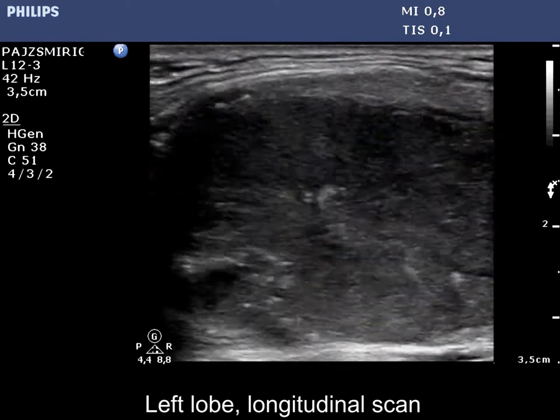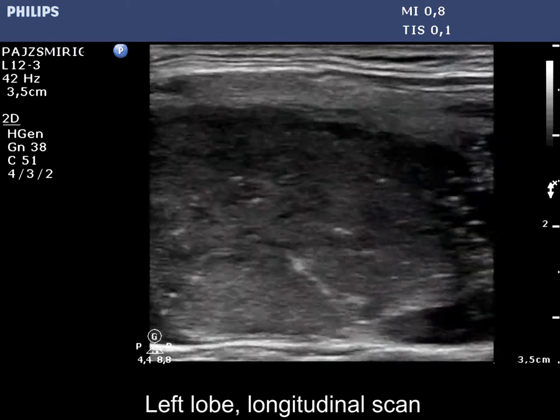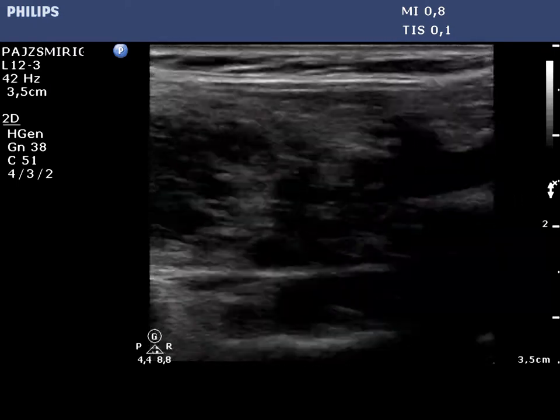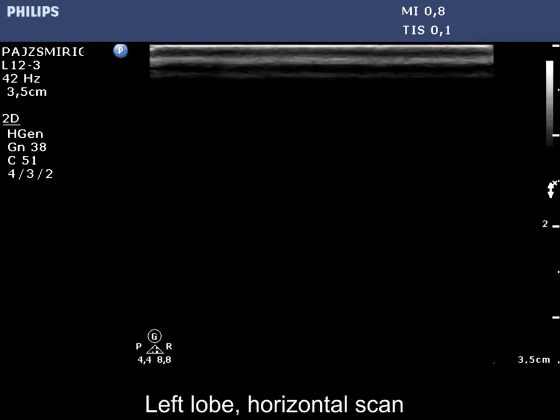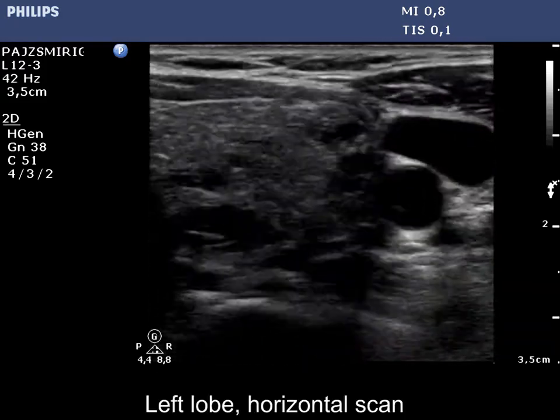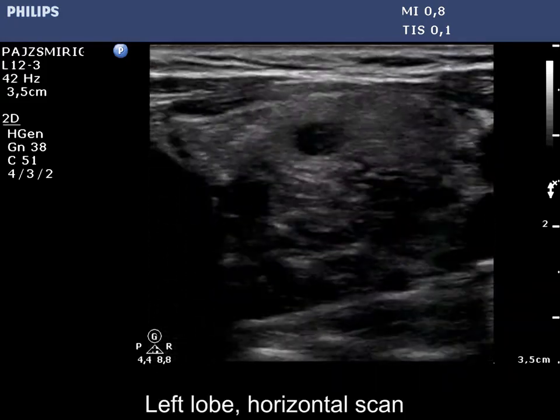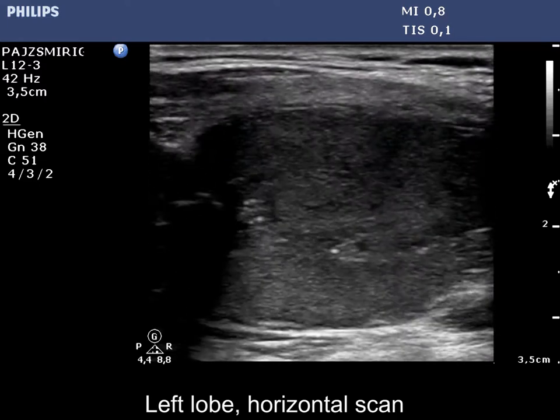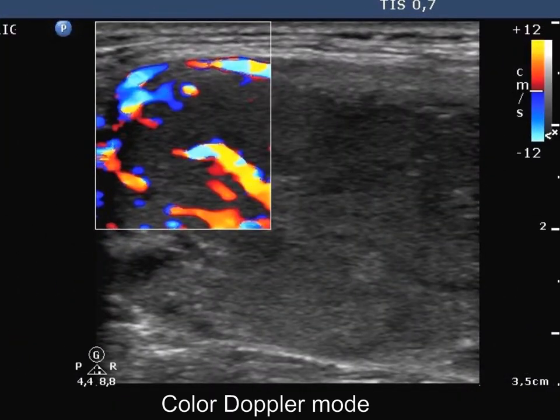The fibrotic changes make the appearance inhomogeneous. The inhomogeneity is even more pronounced in the extranodular part of the lobe. The nodule shows intranodular vascularization.